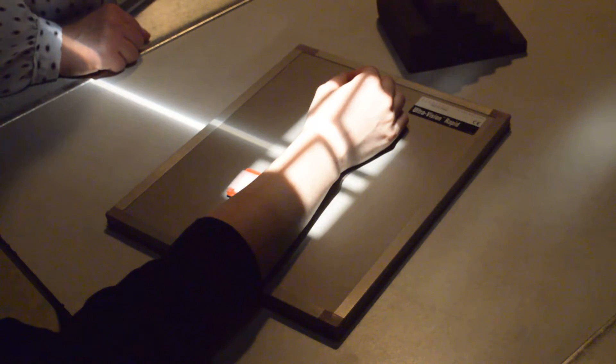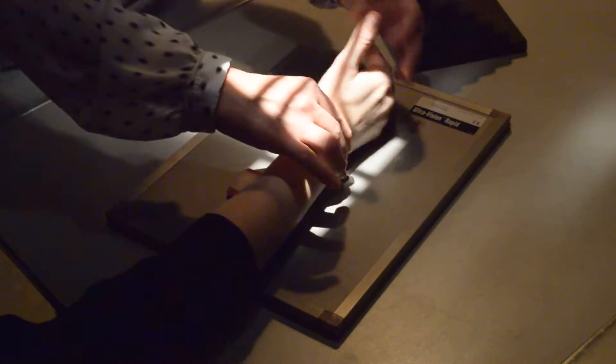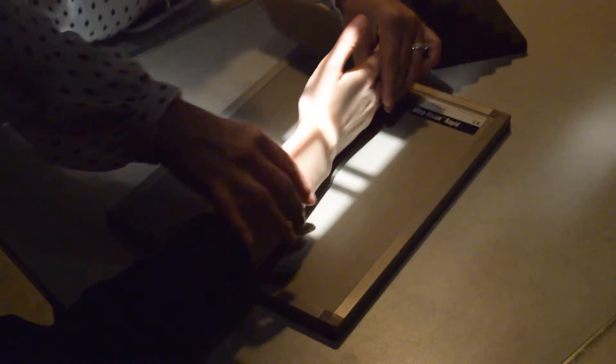And then we're going to do a lateral wrist. So lateral wrist, thumbs up. You want your patient nice and lateral for this.